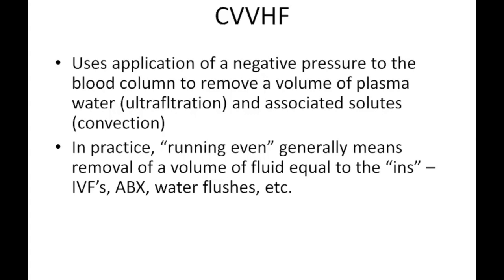And that generally means that the total amount of fluid going into that patient being administered over the course of an hour is being removed by, again, that process of ultrafiltration. So a patient may be receiving 200 milliliters in total of IV fluids, drips, et cetera. And the nurse sums all of that for an hour that's anticipated to go in and sets the machine to remove that equal amount of fluid. If they then select to remove more than the 200 amount of fluid that's being given, then the patient's running negative.